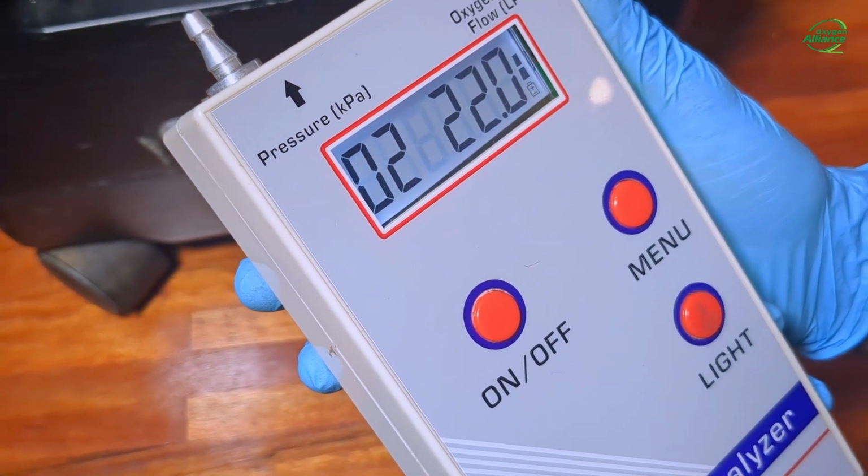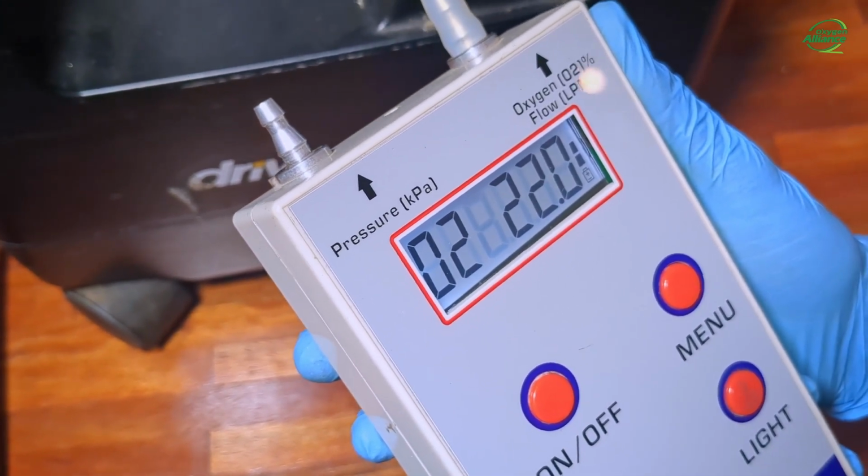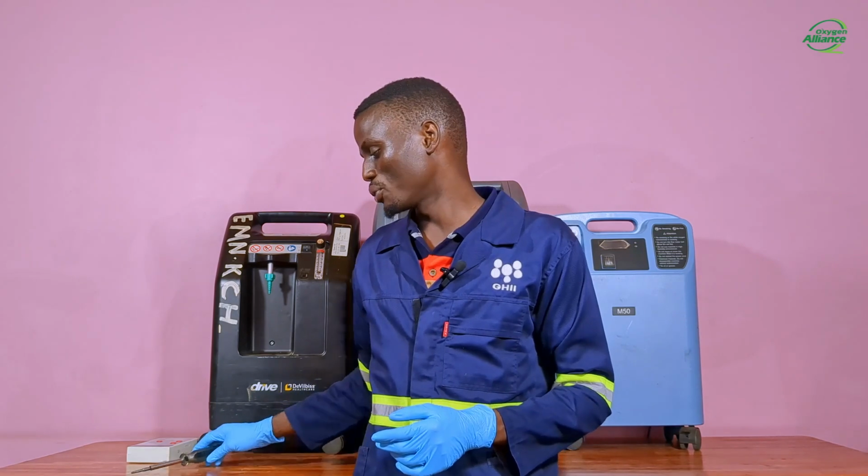As you can see, the analyzer is showing a purity of about 22%, which is relatively low. Assuming that you have verified that the correct voltage is supplied to the machine, the filters are clean and there are no leakages, you can go ahead and open the unit to inspect the valve. To do this, I will use a T25 screwdriver.